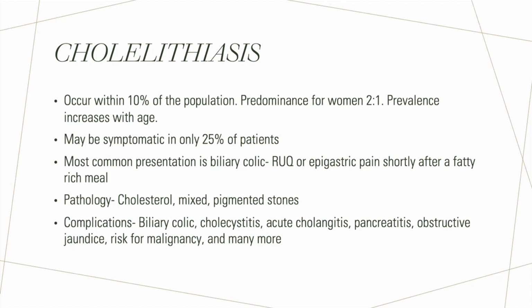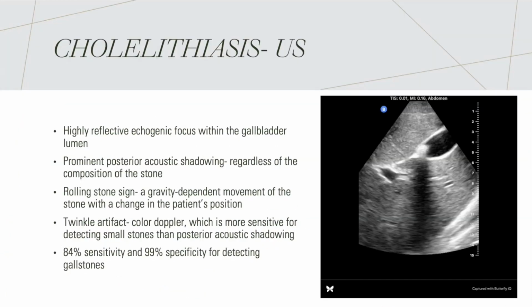There are many complications of gallstones. Those listed here are biliary colic, cholecystitis, acute cholangitis, pancreatitis, obstructive jaundice, risk of malignancy, and many, many more, as we'll go through some. So here in the image, we see some gallstones on ultrasound.